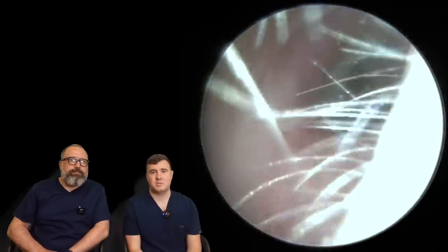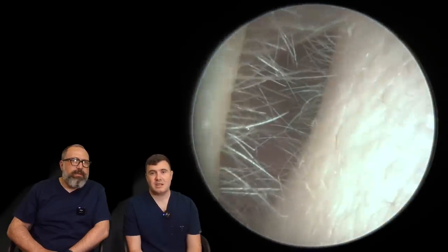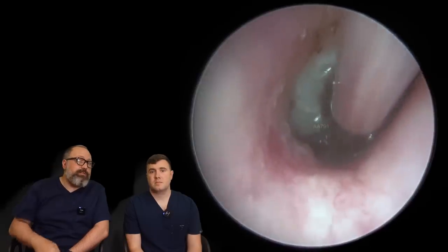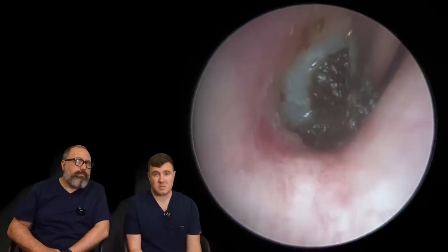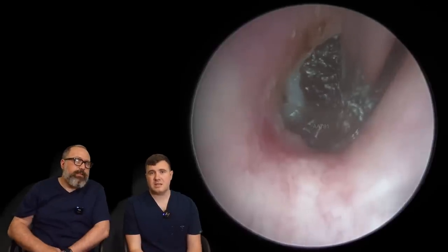With this particular patient, you can see there's not much wax but it's been pushed in very, very deep — clearly cotton buds being used, the usual culprit. When it's deep like that, patients complain a lot more about the feeling of fullness and dullness. Some people can actually feel it there even if they don't have much issue with their hearing. It's coming away nicely.